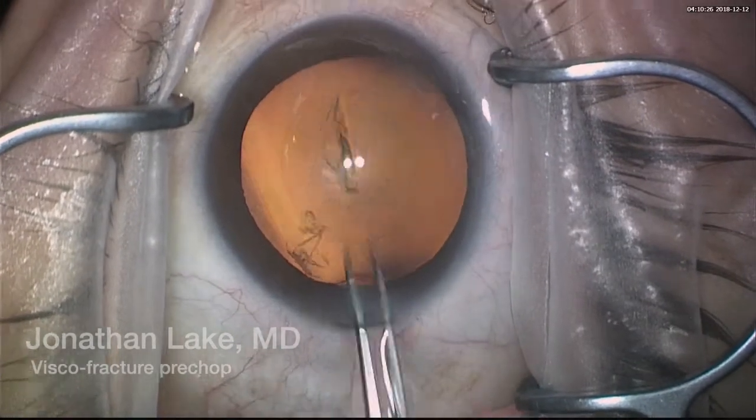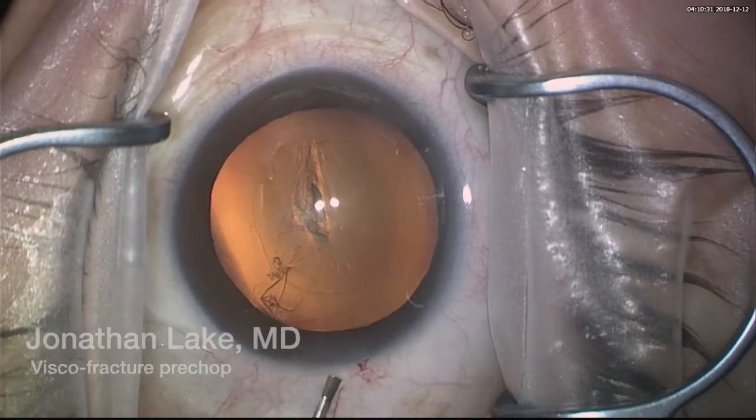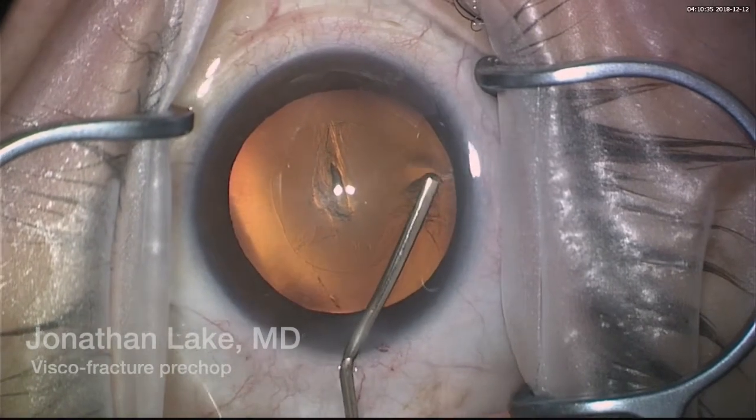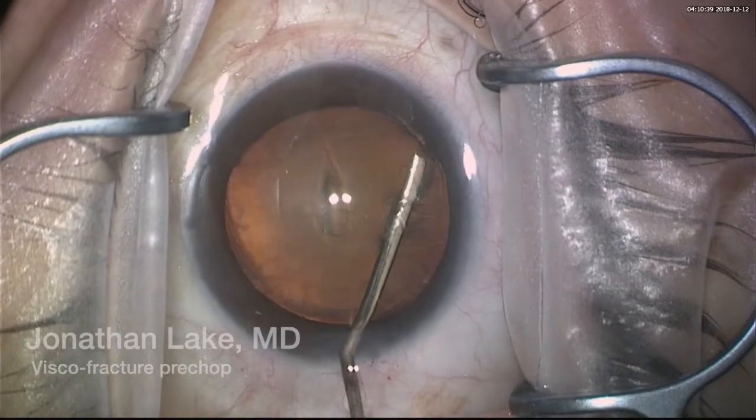I'll measure the rhexis right now using the same device — about five point five millimeters, which is great. For hydrodissection, I elevate the anterior capsule a little bit, and that should allow for a good pathway for the BSS to go through.